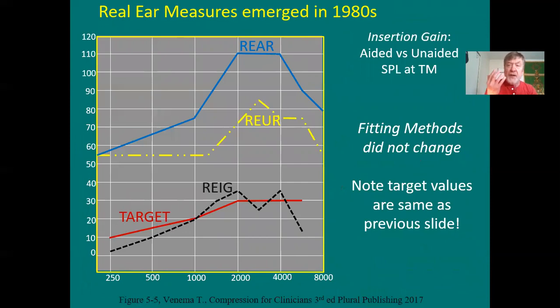Okay, average speech was your main signal of interest, because that's what most people are listening to with the hearing aids, is average input speech of 65 dBSPL or 55 dBHL.